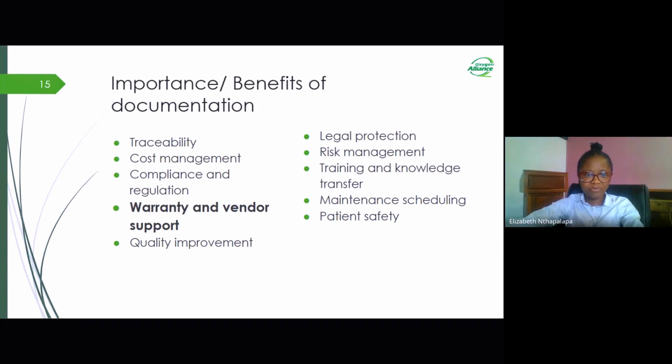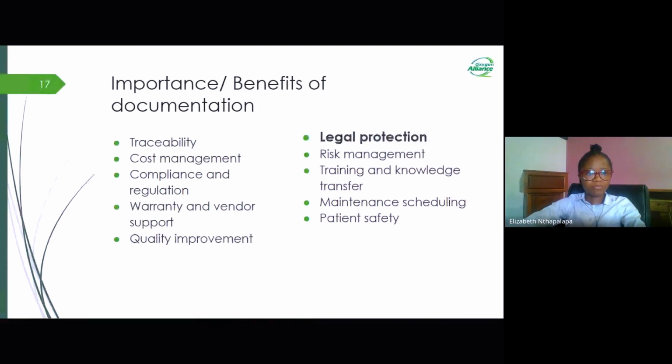Another importance that we have is quality improvement. Analyzing equipment documentation can reveal the patterns of malfunction or wear, and this leads to improvement in the equipment selection and maintenance processes. We're continuing with the importance of documentation, and the next one is legal protection. In case of malfunctions or any adverse events, well-documented procedures can provide legal protection by demonstrating that the equipment was really handled and maintained in accordance with every best practice that needs to be done in the facility.